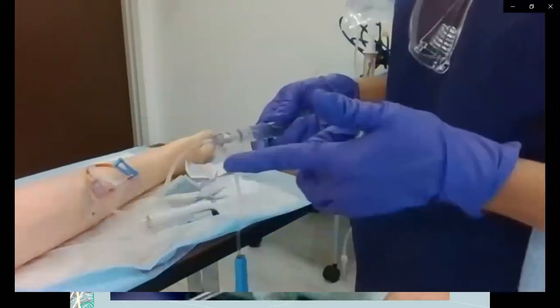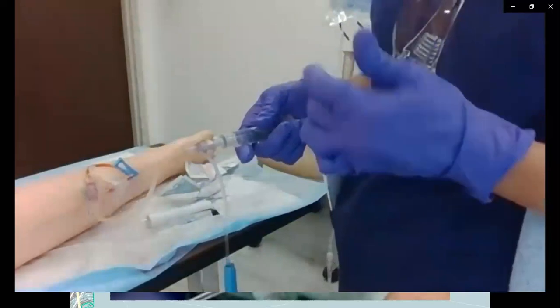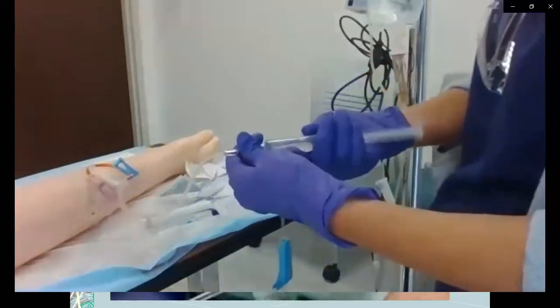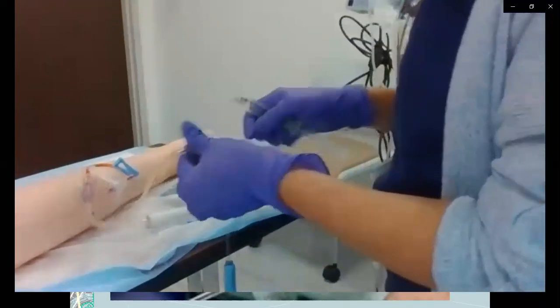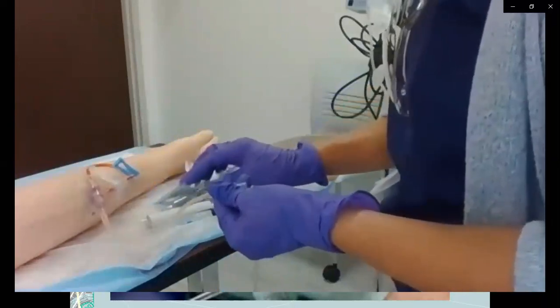So flush, med, flush. If you're given multiple medications, it's flush, med, flush, med, flush, med, flush. Start with flush, end with flush. Give a flush between every IV push medication. Okay, and that's it for IV push medication.